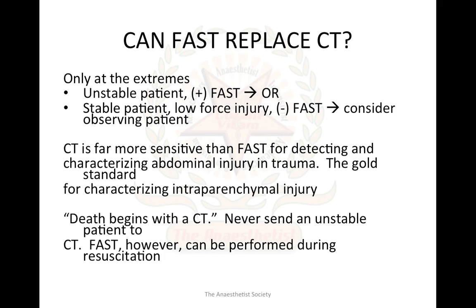Can FAST replace CT scan? No, it cannot, but it is helpful in certain conditions. Like if the patient is unstable and FAST is positive, then ship the patient to the operation theater. Don't wait for CT. FAST positive, then you have to explore the patient. If the patient is stable, low force injury, negative FAST, then we can consider observing the patient, or we can go for CT. CT should not be attempted in an unstable patient with positive FAST. If FAST is positive, then go for surgery.